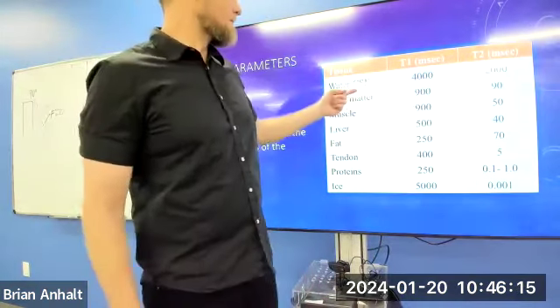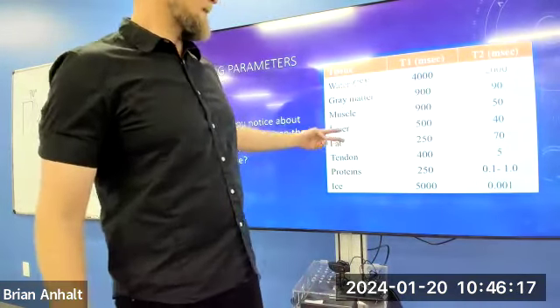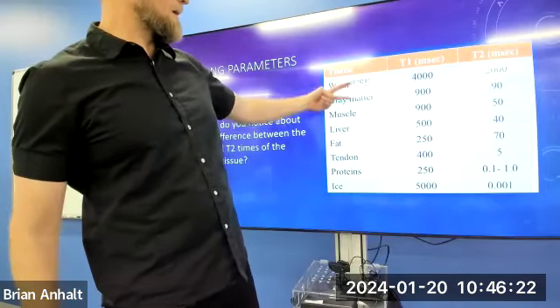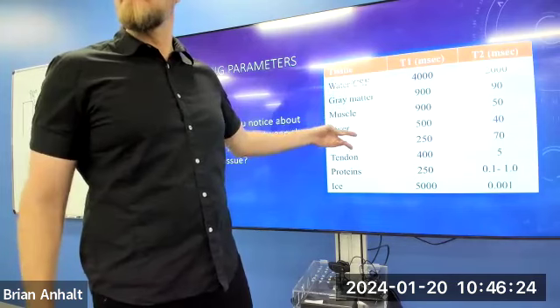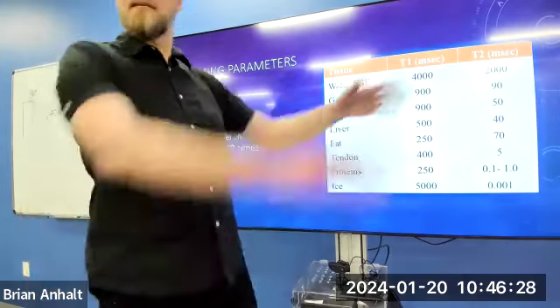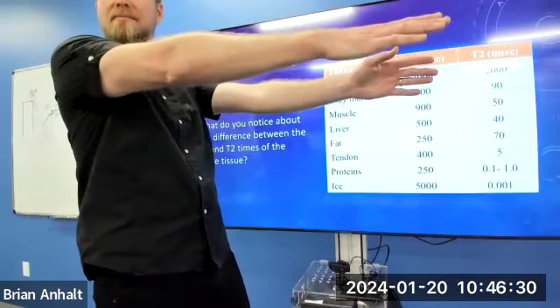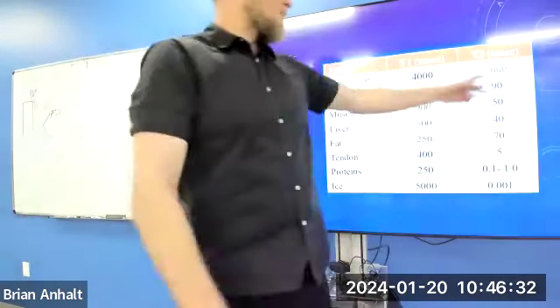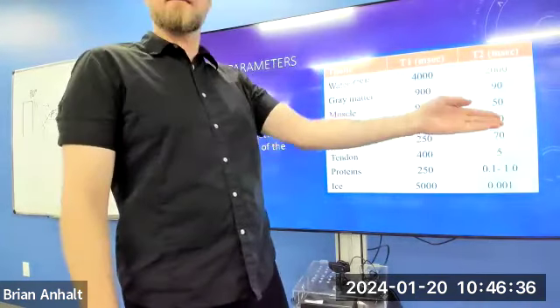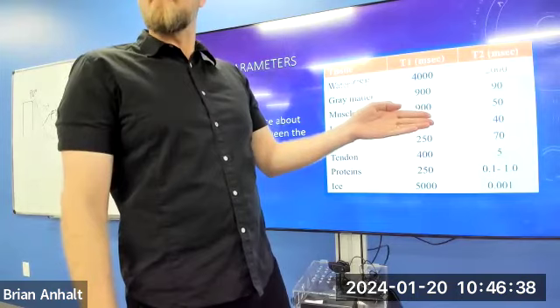So if I was imaging a volume that had water and fat in it, right? And I waited 1 second until we listened back to the signal, water isn't even going to get back to that 37%, right?